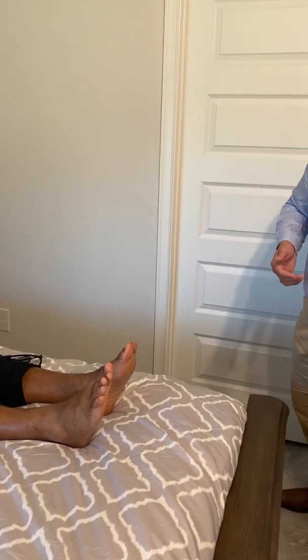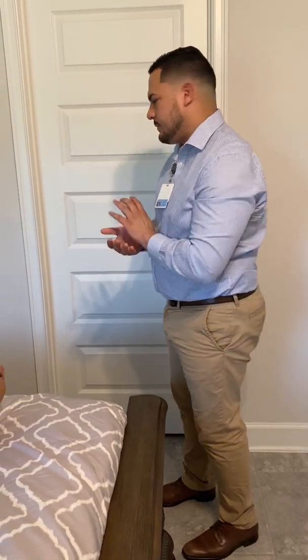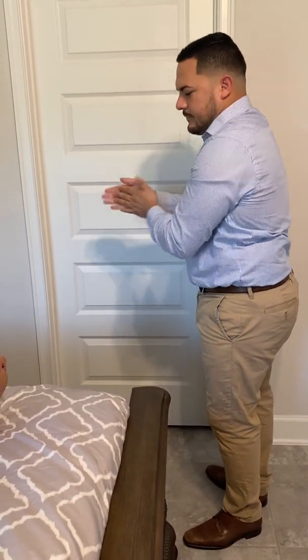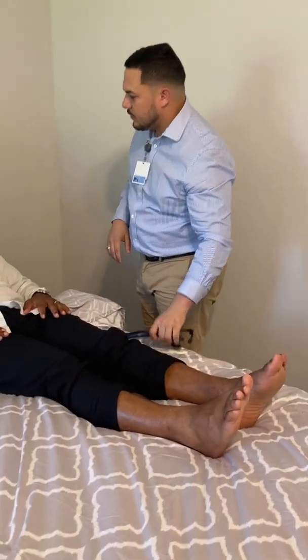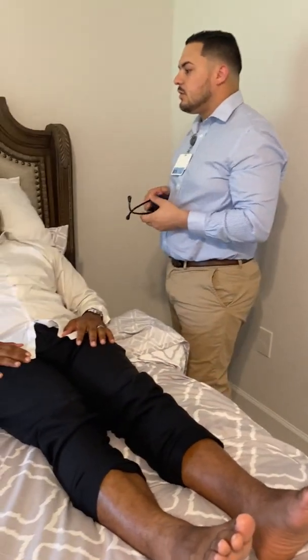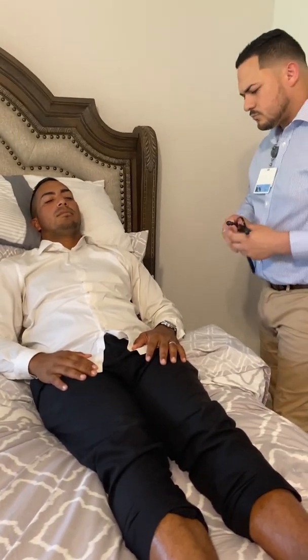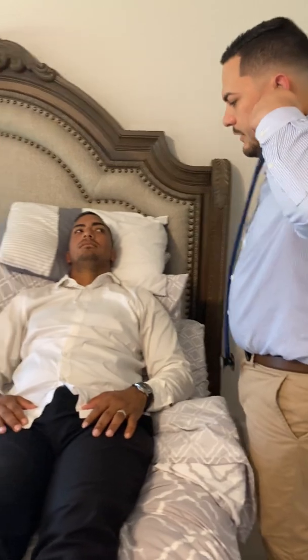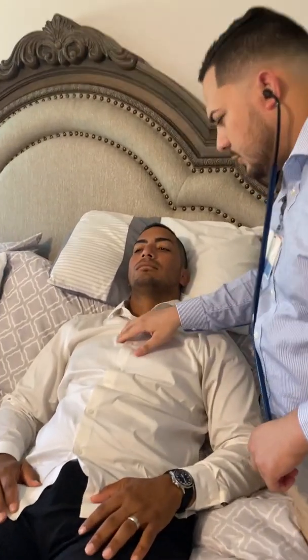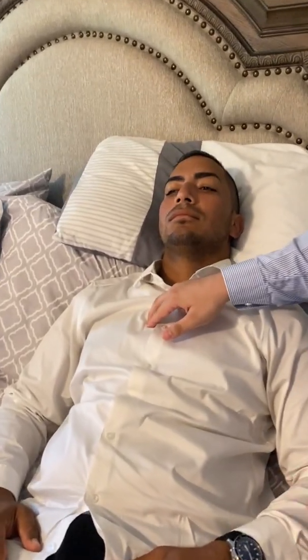Now I'm gonna wash my hands again before I start my cardiovascular assessment. I'm gonna grab my stethoscope. I'm gonna listen to your heart valves, okay? So first I'm gonna place my stethoscope on the second intercostal space next to the sternum, and that's gonna be the aortic valve.